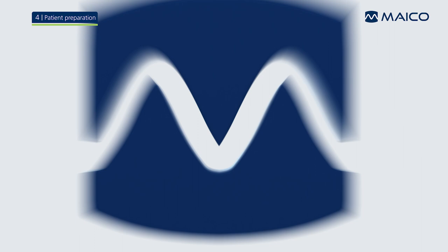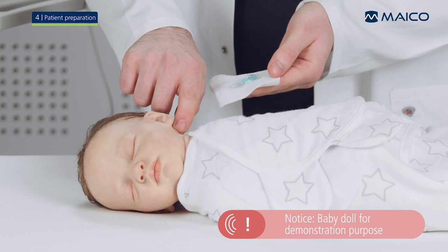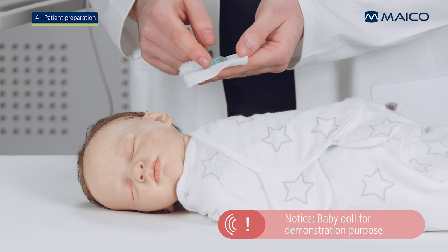Place a small amount of electrode gel on the tip of your finger. Massage the gel gently into the skin at the electrode spots 10 to 15 times. Be sure that the gel from one location does not mix with the gel from another spot.